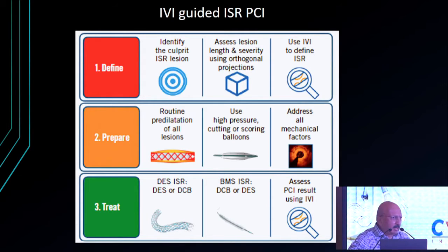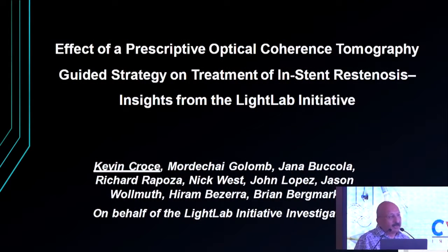And today, with so much drug-coated balloon technology coming up, and it's already there, many patients, like 80% of patients, are being treated by drug-coated balloons after vessel preparation by a laser or a cutting balloon. And then, of course, finally reassess how you have done, doing an OCT or an intravascular ultrasound. So either of these can be done.